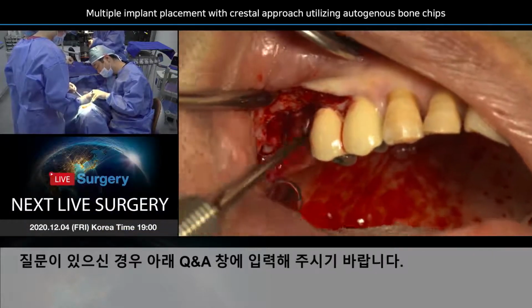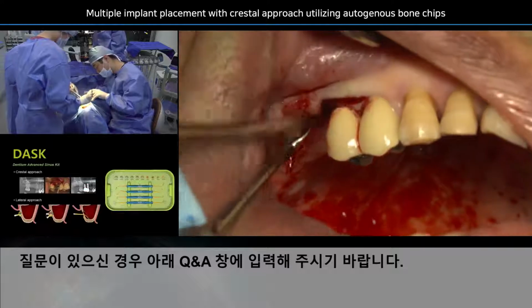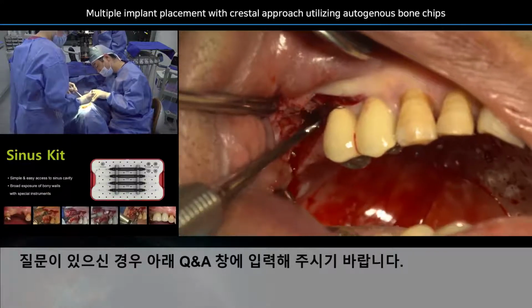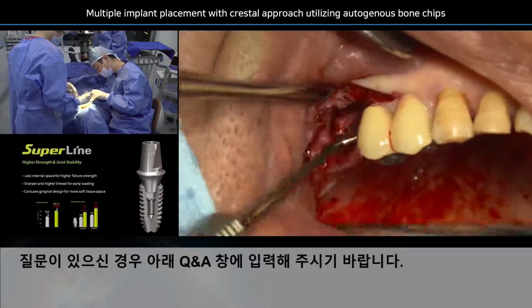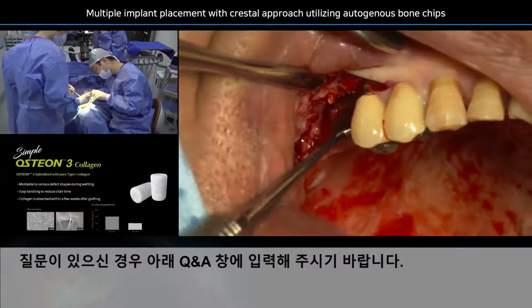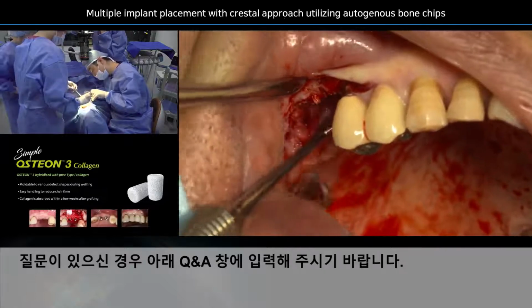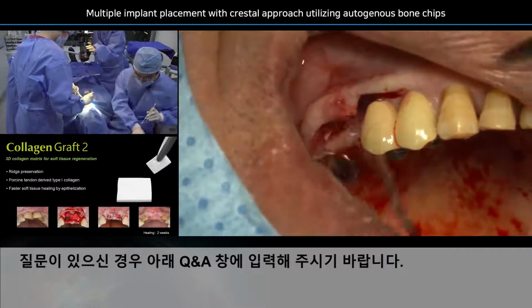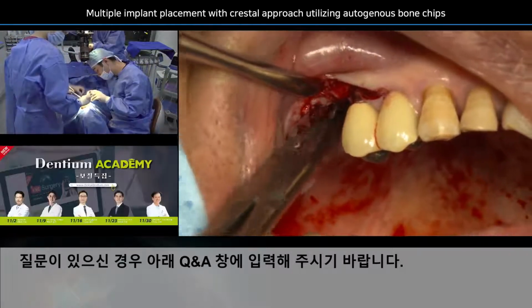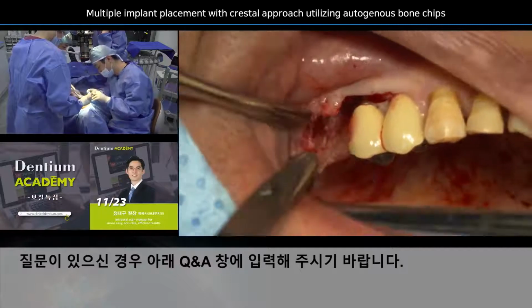And additional soft tissues there. So we were planning to place 4.5 millimeter implants, and I think that it was quite a nice idea because we do not have a really wide bone here. So there's a lot of resorption, buccolingually too. So please always do not believe your CBCT images, because sometimes they have deceptions, so you may be fooled. So we will start the osteotomy, the drilling, but later on we will have to see whether maybe we should do the submerged healing. We were thinking that maybe we can place the healing abutment today, but I don't think so. Maybe we will have to submerge today, but we will see. We will do our best to prevent it.